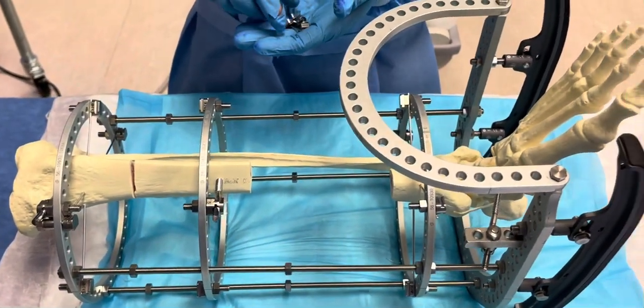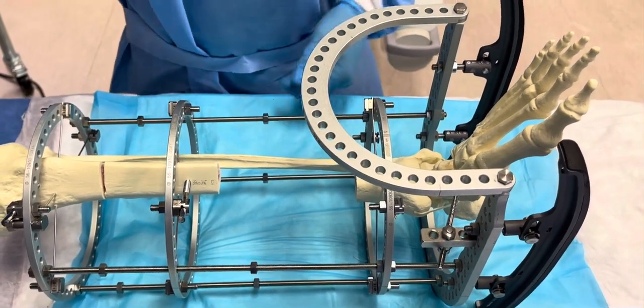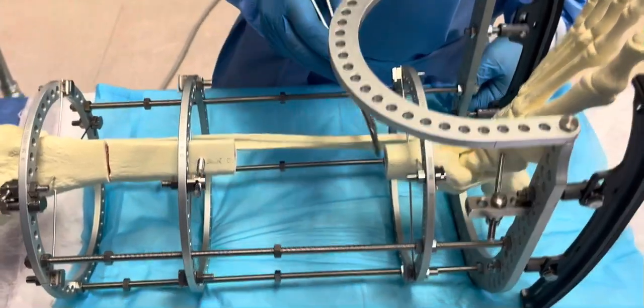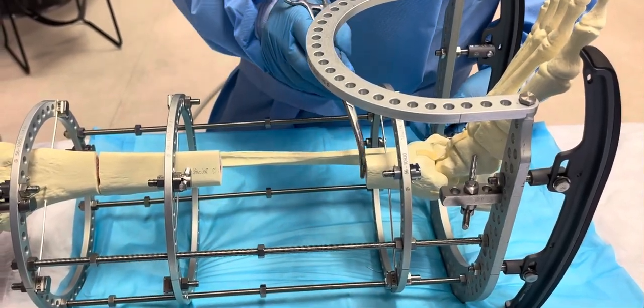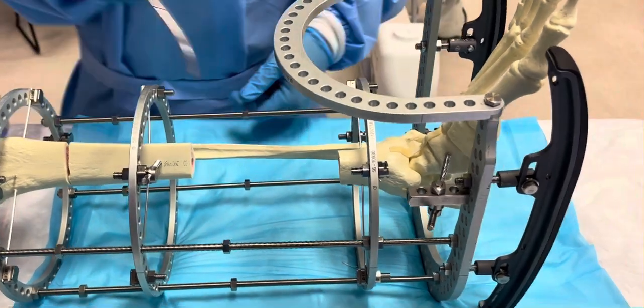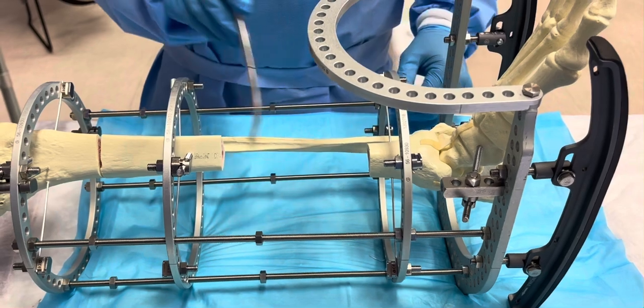This will be the second orthoplastic frame assembly. Imagine that you have a distal diaphyseal segment — it could be an infected area, it could be a sarcoma of any type, or anything post-traumatic that has really destroyed this area.